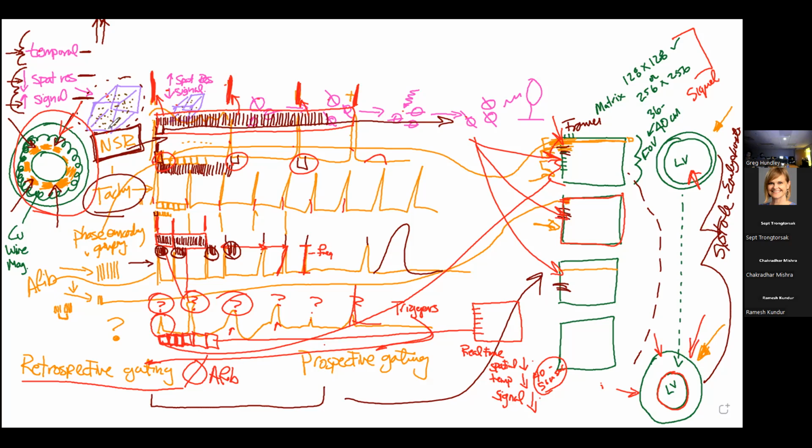When we go to reorganize the images, most of the time in these two top situations, tachycardia and normal sinus rhythm, we're using something called retrospective gating. You hear the scanner, breathe in, breathe out, hold your breath. All the information is being just collected constantly. And then after the fact, retrospectively, the computer goes back and reorganizes all this stuff based on the triggers that it saw.